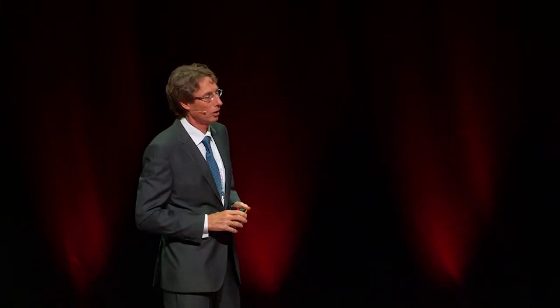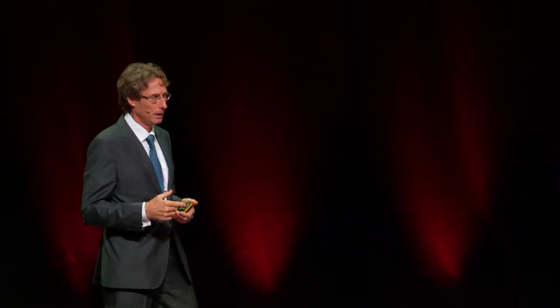So we lost only one implant, so it's a 99% implant survival rate. That's in our practice superior to what we have in the rest. All the prostheses survived. We didn't have to change. Well, we changed one because of the chipping, but it was just the chipping, and we wanted to try the new method.